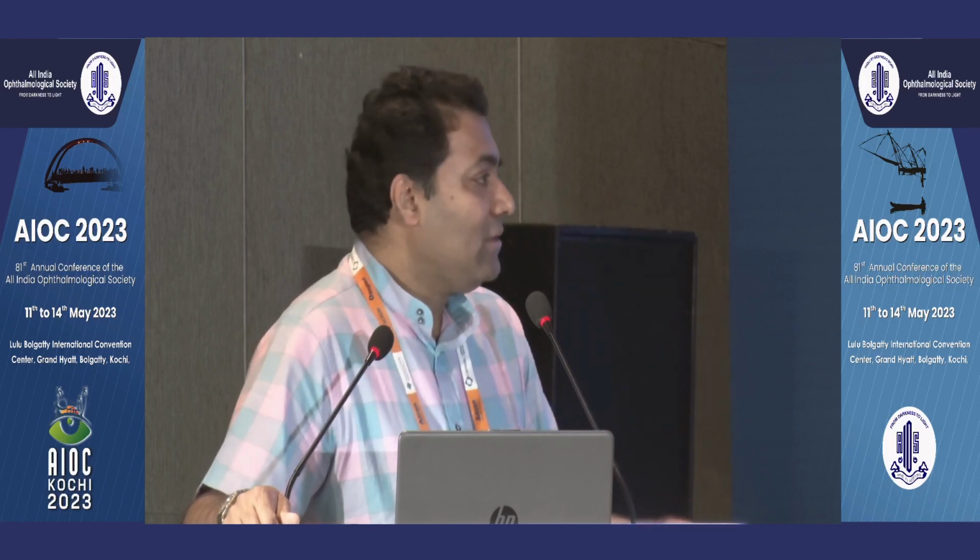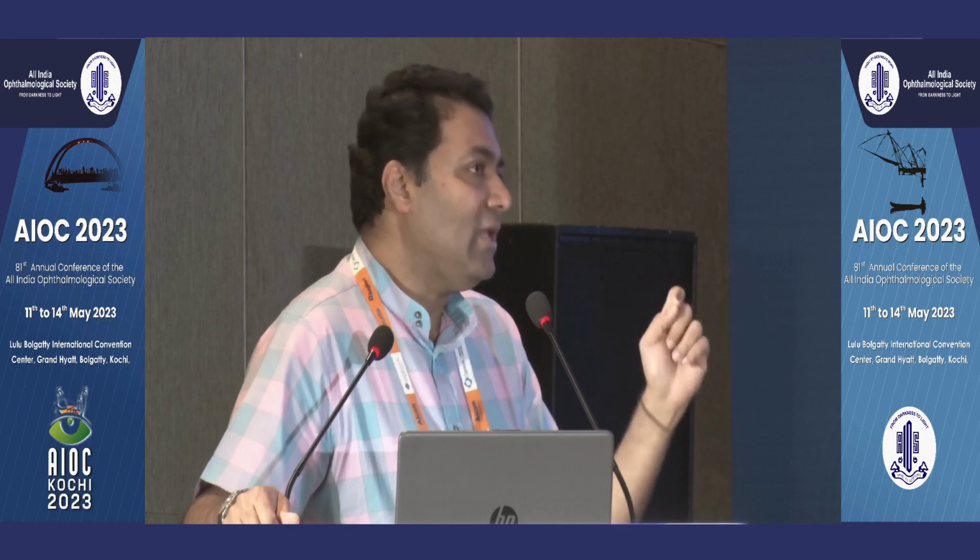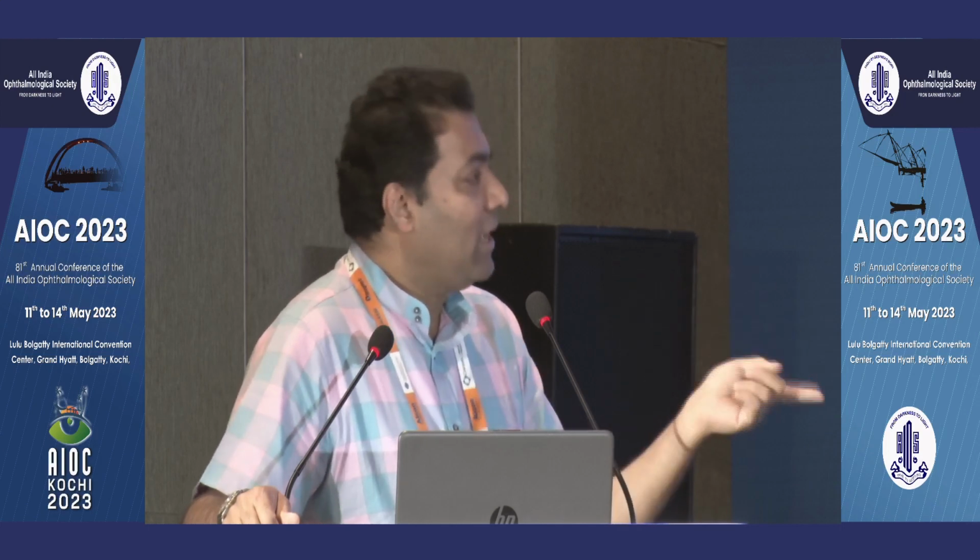So the only way to measure is scanning electron microscopy, but that's not possible. It will burn the whole eye. The second way is the non-invasive one. It takes just 95 seconds per eye, and the software, we have only just developed it.